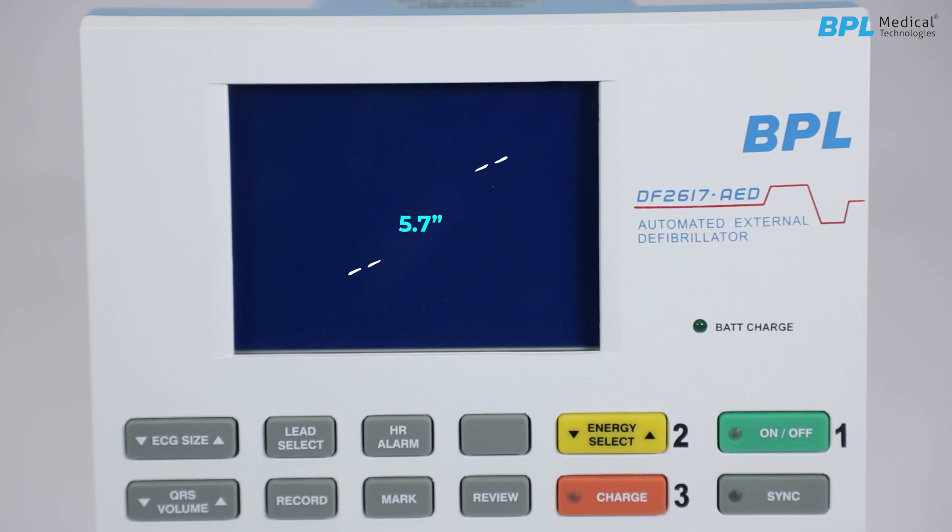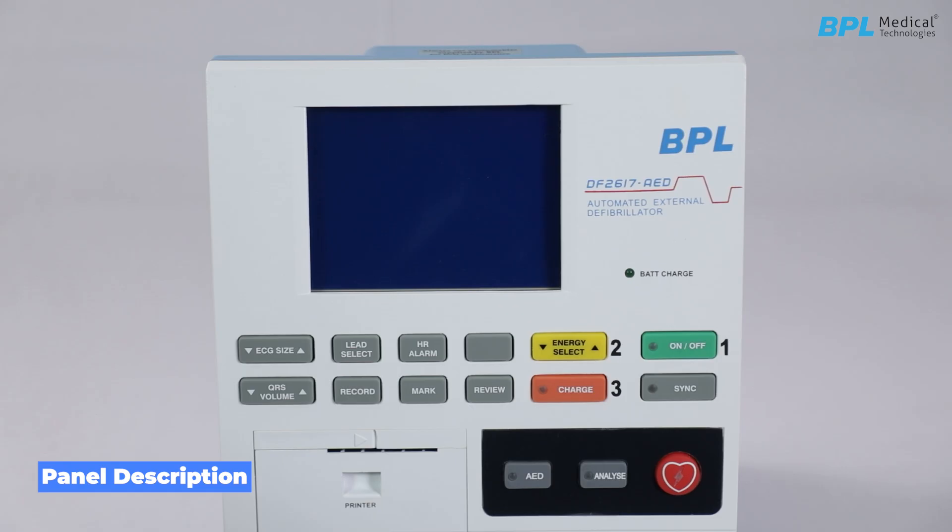At the top panel, there is a 5.7-inch LCD screen. Panel Description — front panel operating controls.